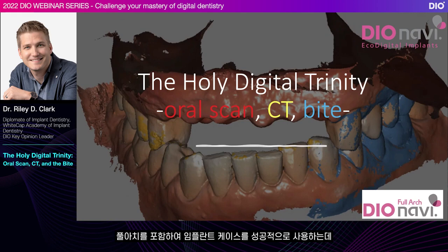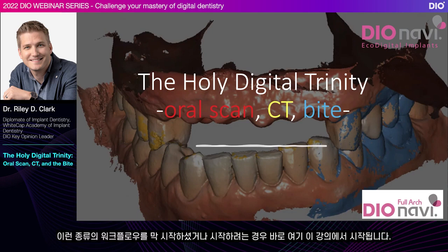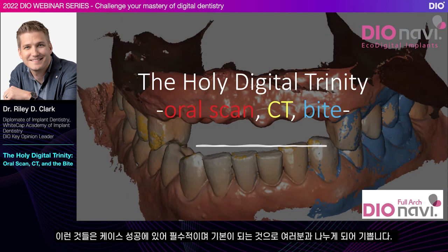I'm excited to talk to you guys about these diagnostic processes that are most important for us being successful with our implant cases, and a special focus on our full arch implant cases. And so if you are getting into this sort of workflow or wanting to get into this workflow, it all begins with this lecture right here. These things are fundamental and basic to the success of our cases, and I'm excited to share all this with you.